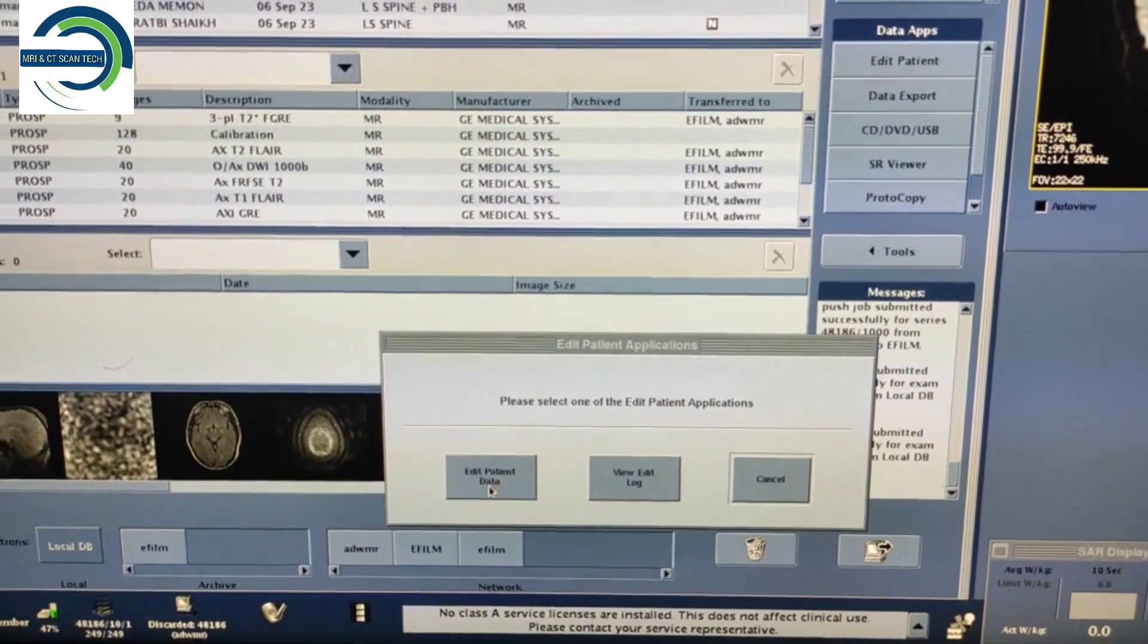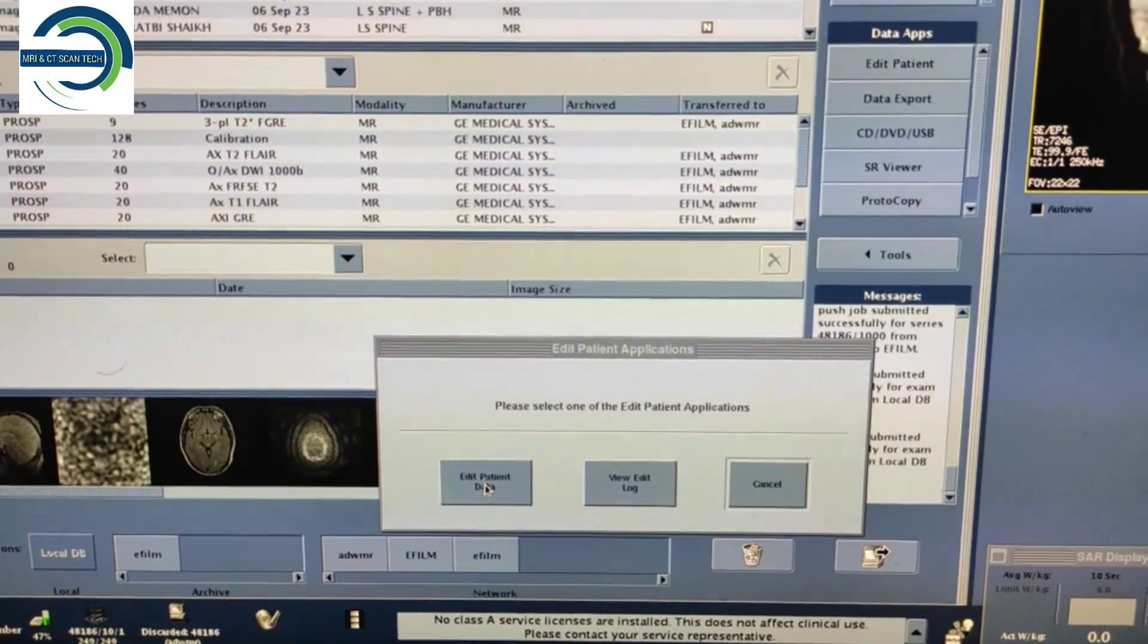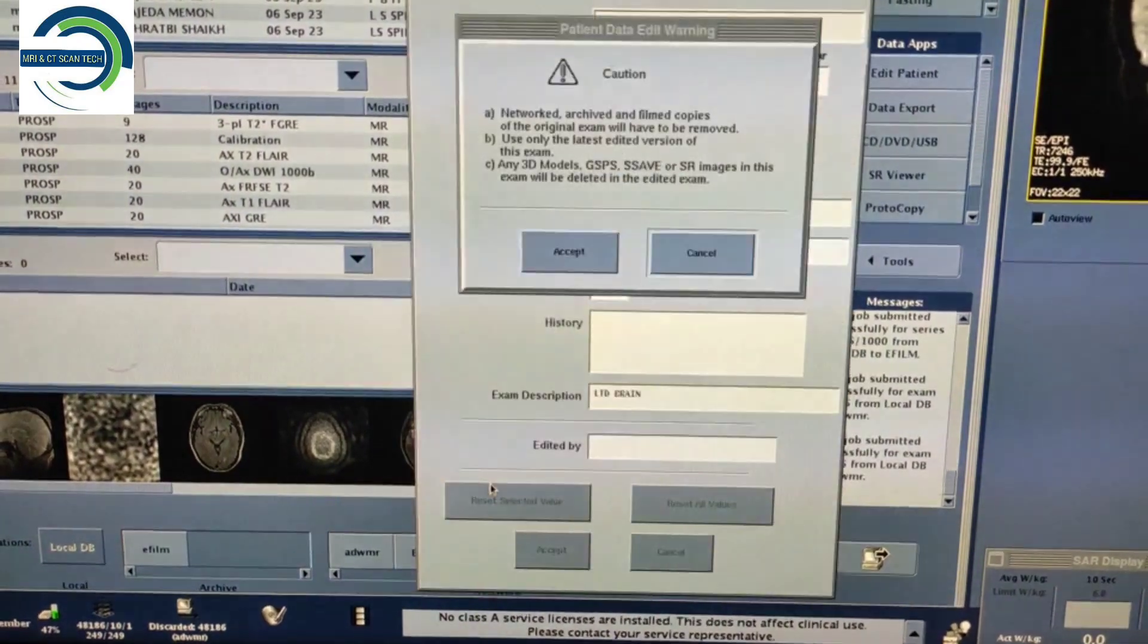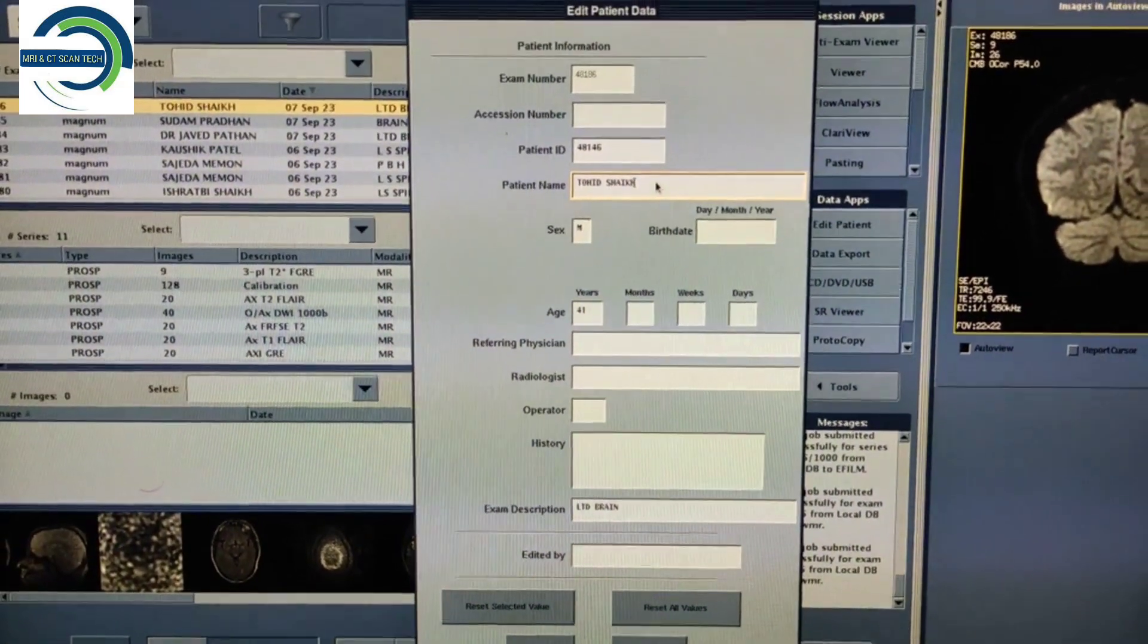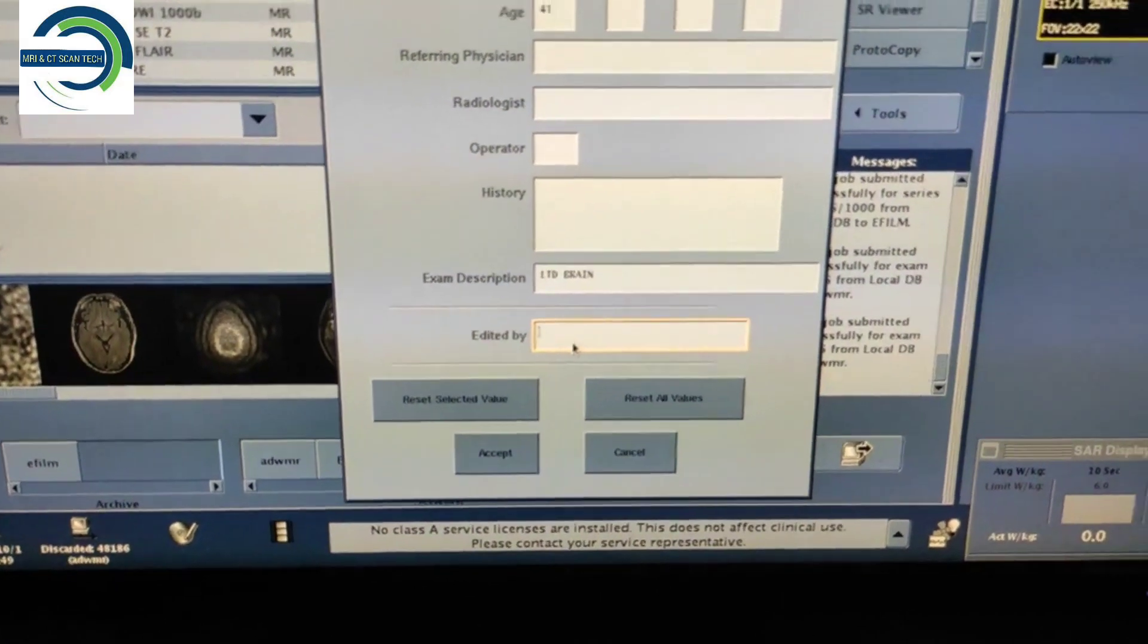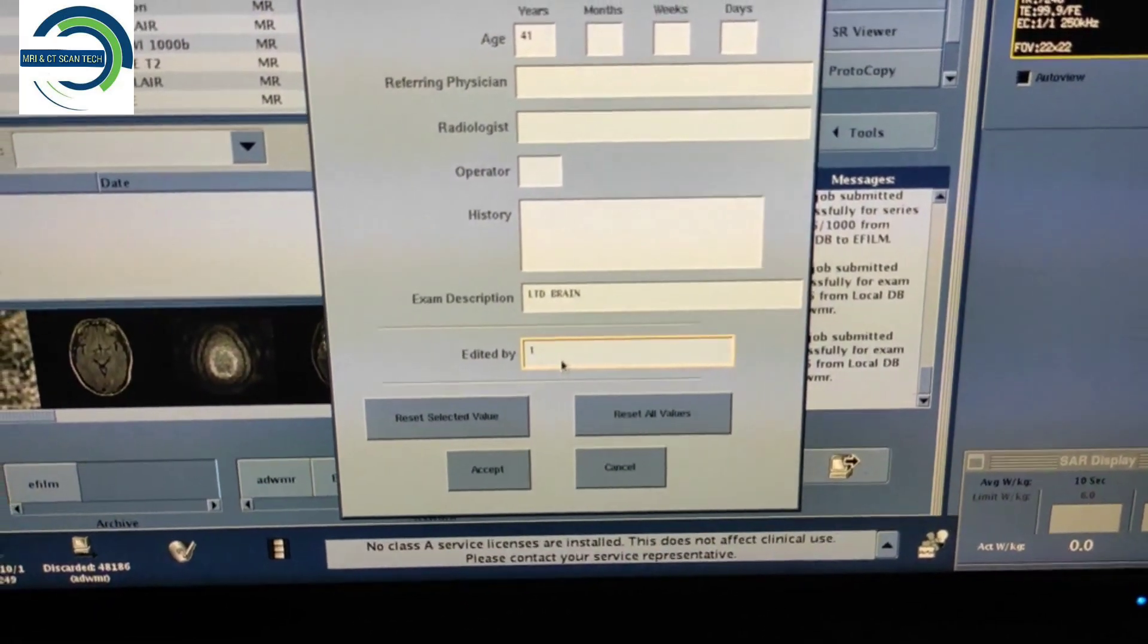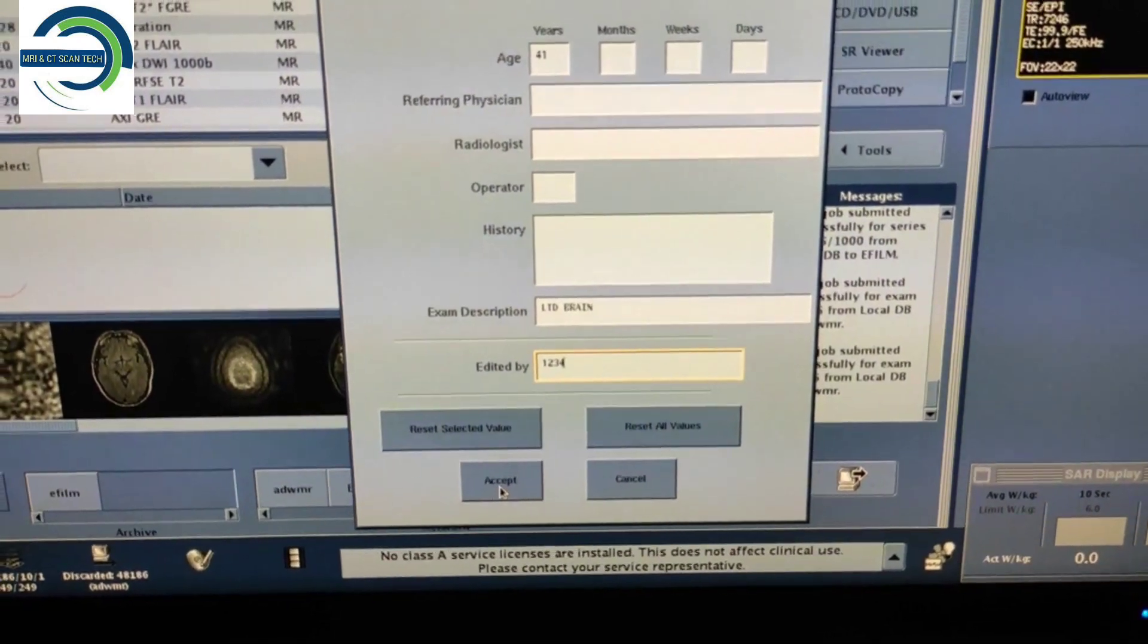I know this thing everyone knows, but some freshers do not know, so that's why I am making this video. Again, Edit Patient Data, then Accept. You have to change the name over here to whatever you want and edit it by writing your name or just enter 1234 and accept.